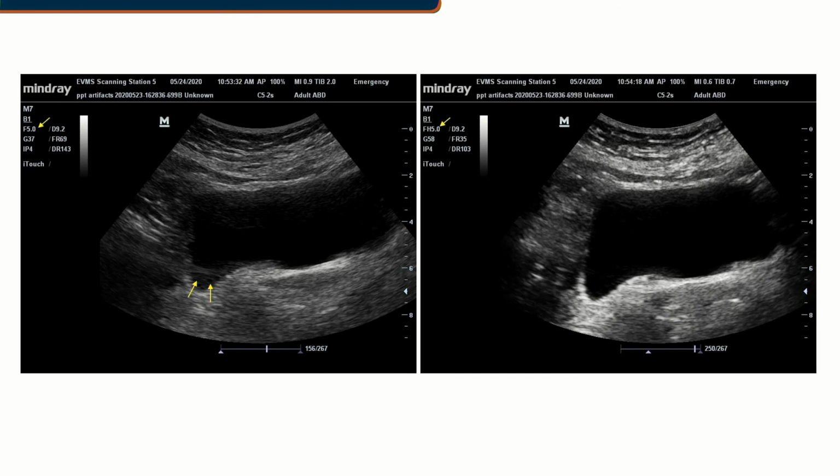So if I show this image, again looking at where that arrow is, you see an H right in front of the 5 megahertz. And that is telling me I have harmonics on. So harmonics is listening to that second harmonic return from the main beam, and so is less inclined to listen to some of these side lobes or throw those signals out, and we're able to clean up the image that way.